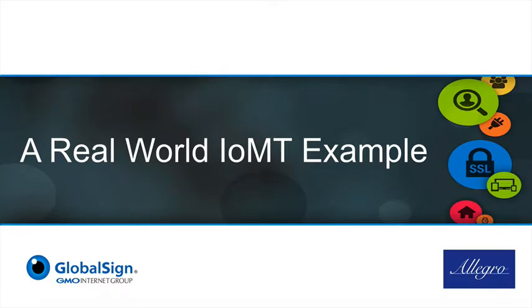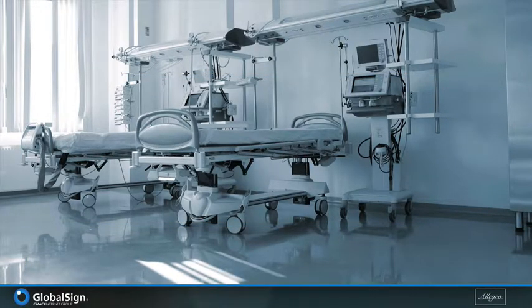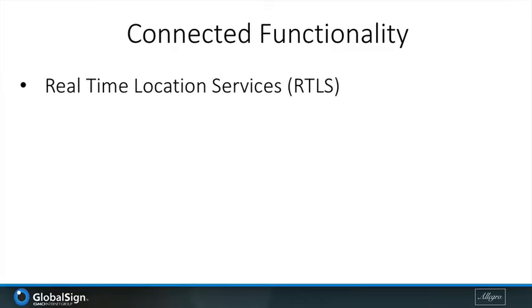To really understand the concept of using PKI with an IoMT, let's look at a specific example. Let's take a look at a hospital bed in a healthcare environment. There's a lot of connected functionality built into many of the new hospital beds. One of the most prevalent is real-time location services, called RTLS. That gives patients and caregivers the actual location of not only where the beds are, but the hospital can also understand where the patients are by implementing a simple RFID tag into the patient's band.